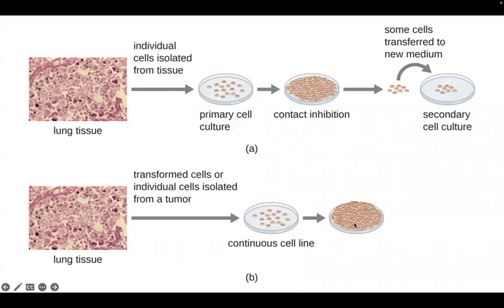So continuous cell lines are barely used for vaccine preparation or for isolating the virus. Most of the time, they are used to generate antigens that will be used for diagnosis commercially in large numbers. So it's only the primary cell lines and the semi-continuous cell lines that can be used to either isolate the virus or make vaccines.